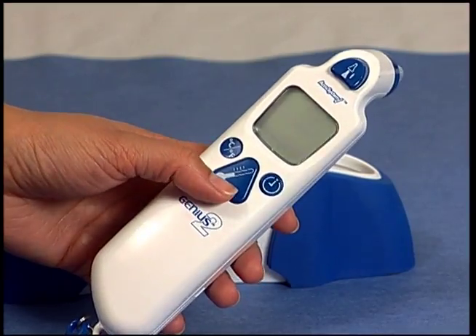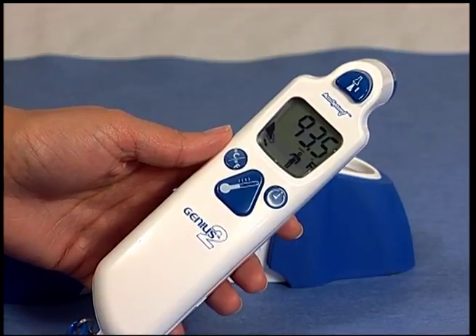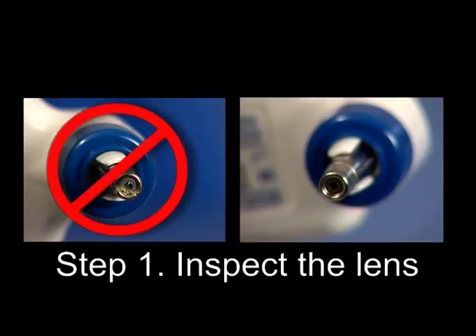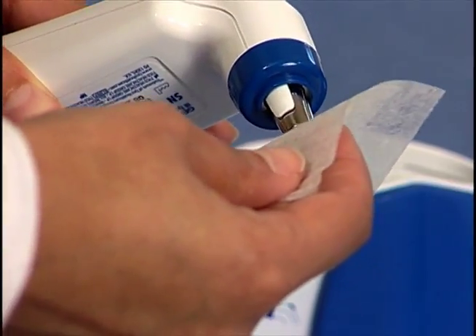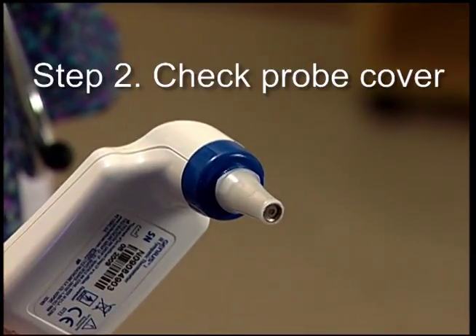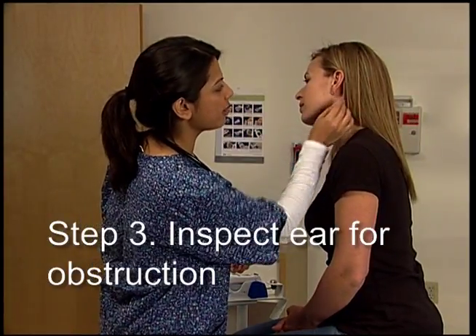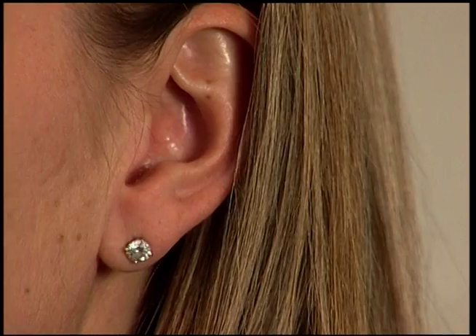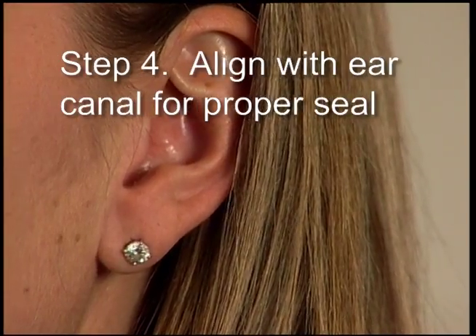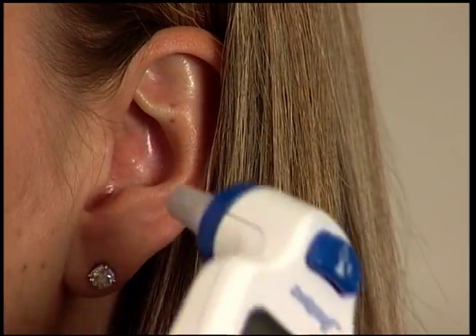If the Genius 2 is providing consistently low or incorrect temperatures, please take the following actions: 1. Inspect the lens — is it perfectly clean? Clean the probe lens if needed with a dry lens wipe, dry lint-free gauze, or dry cotton-tipped applicator. 2. Is the probe cover on properly? 3. Did you inspect the patient's ear for obstructions? Try the other ear if needed. 4. Are you aligning the Genius 2 correctly with the ear canal and getting a good seal? Correcting these problems should assure the delivery of accurate readings.